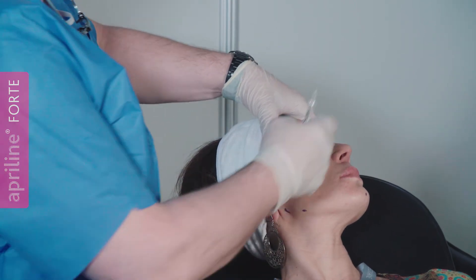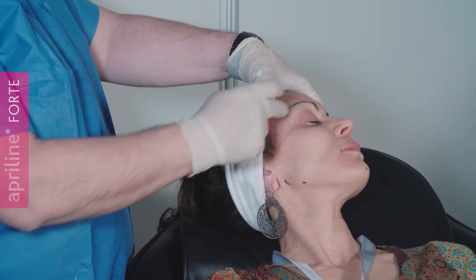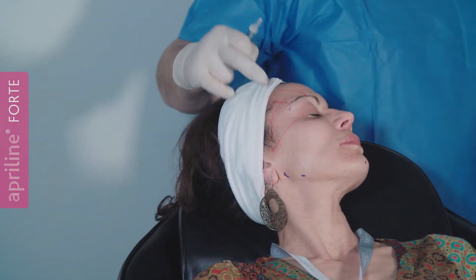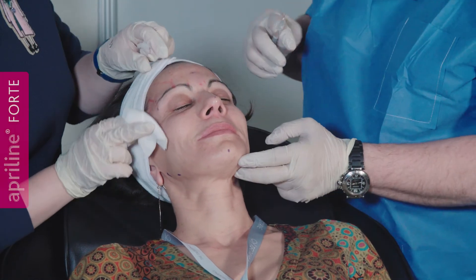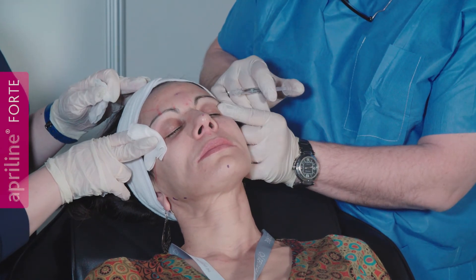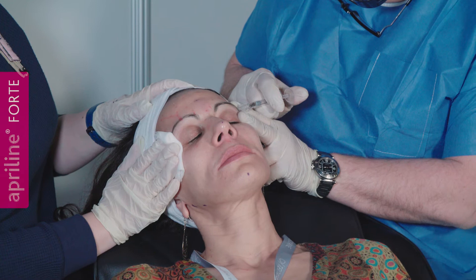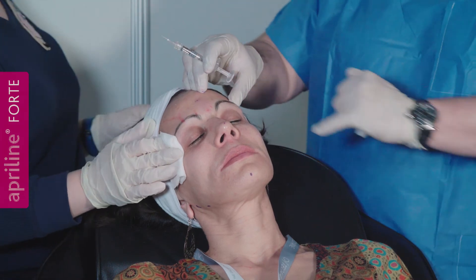What is the goal? I repeat — remember the curve: the youth and the female aspect is the curve of the forehead here and here. The same on the other side — just over the eyebrow — I touch the bone and make my little bolus. Massage. So you saw that I did the forehead, the nose, and the roof.